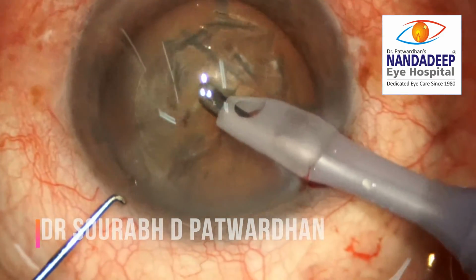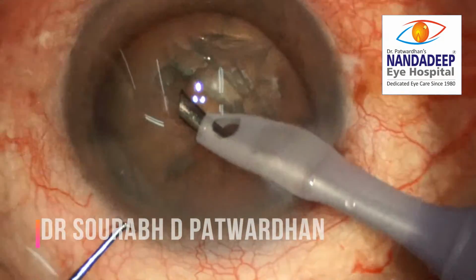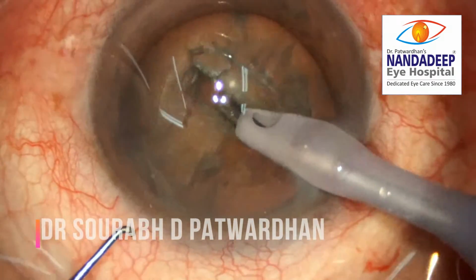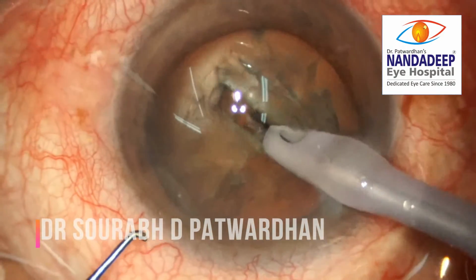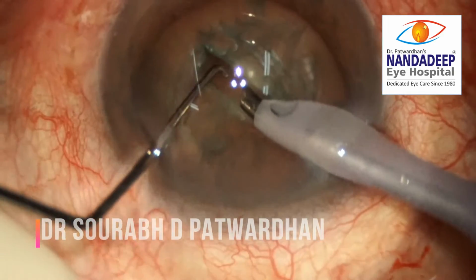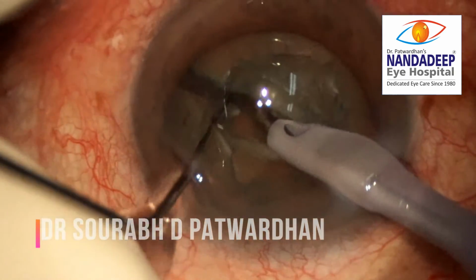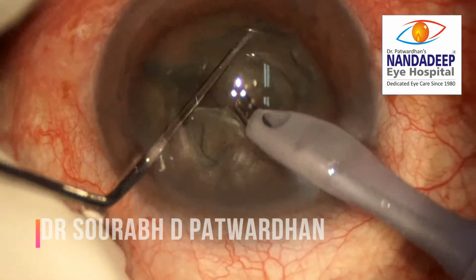So in this case, there are two options. I can suture the wound and make another small side incision and go ahead with the surgery just as usual. But I would like to show you here that once I entered through the side port, you can see the amount of fluid which starts leaking from this incision.